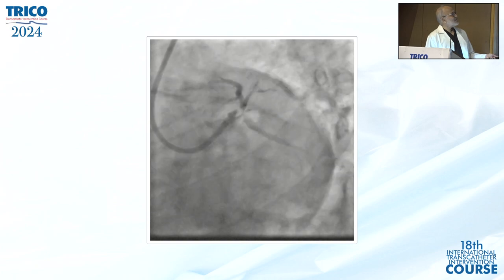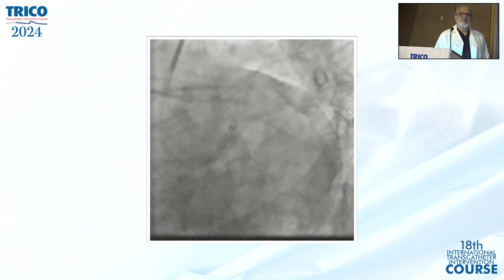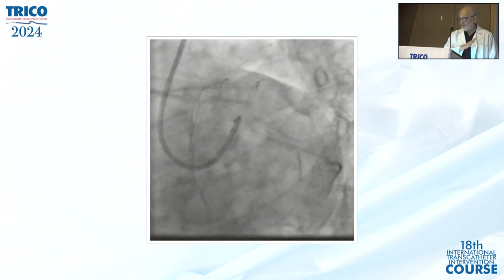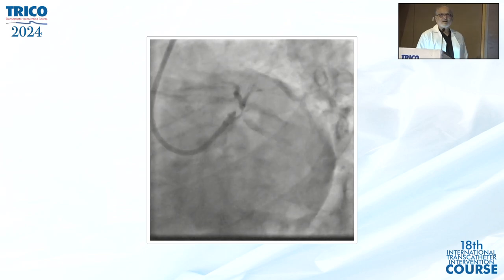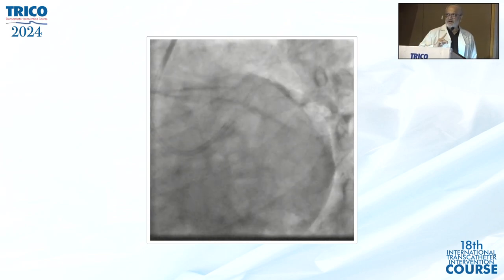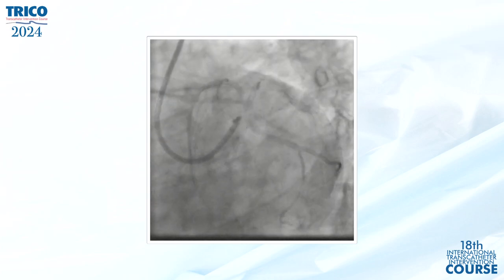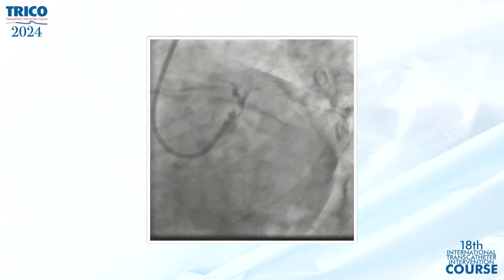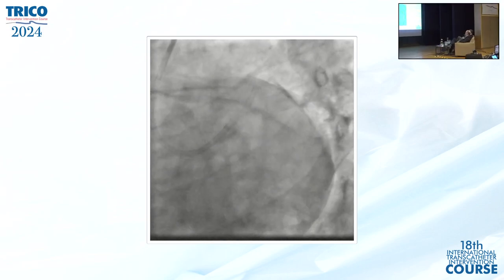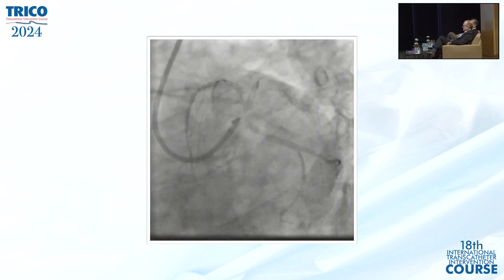And you can see, now my question to the panel: what will you do if you see this picture? And for the young generation also, it is very important. I think you have to pull back a little, try to pass one wire somewhere. Yeah. Anything else? I agree. And don't inject any more. Yes, it's very important. No injection.